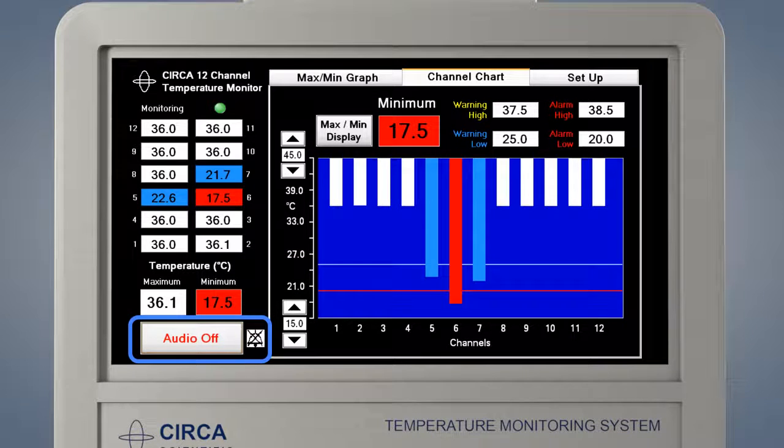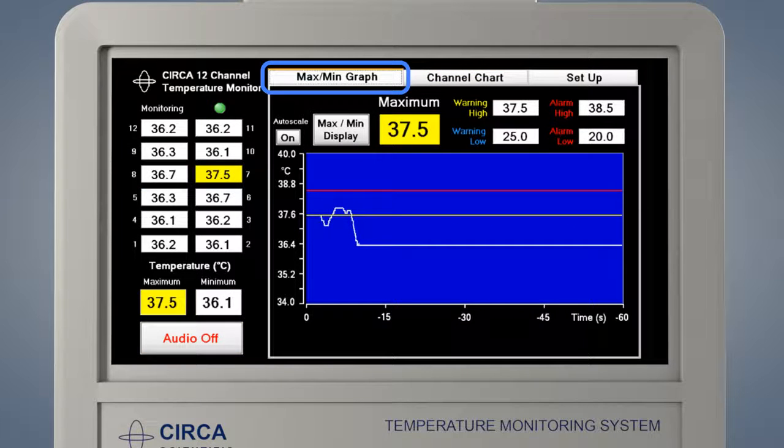The audio off button may be pressed to temporarily silence the alarm. The alarm will be silenced until the next time the temperature crosses a warning or alarm threshold. By pressing the max-min graph tab, the temperature data may be displayed in a different format. The max-min graph display shows only the highest or lowest temperature, graphed over the last 60 seconds. This display indicates the temperature and the rate of change. The alarm settings and alarm functions operate in the same manner as the channel chart screen.